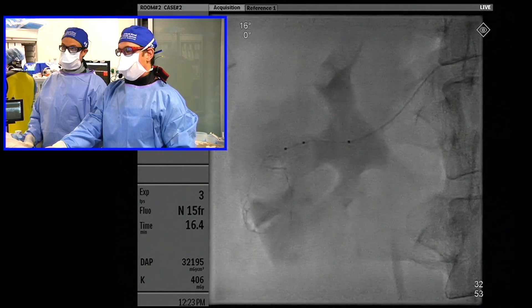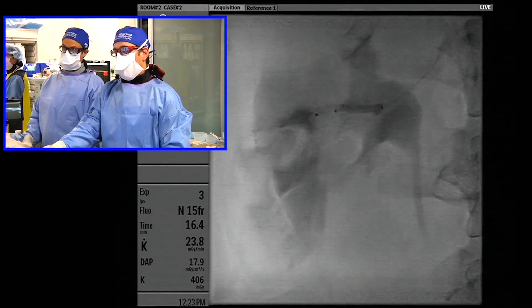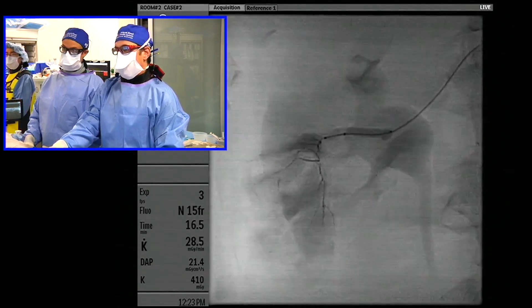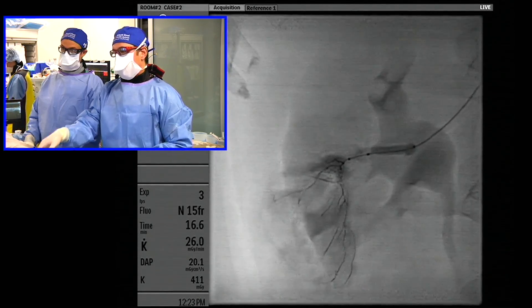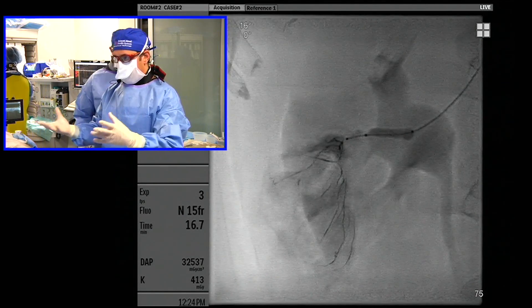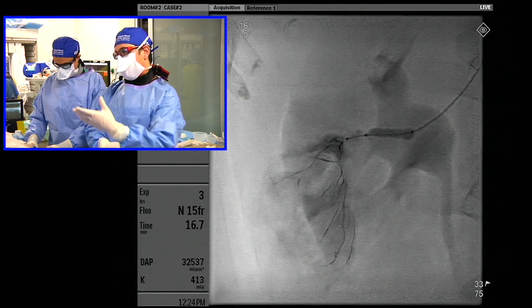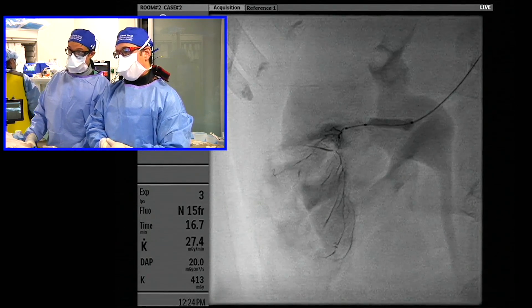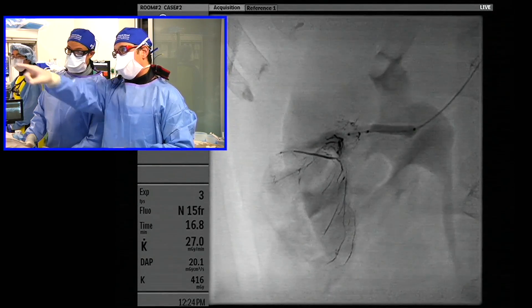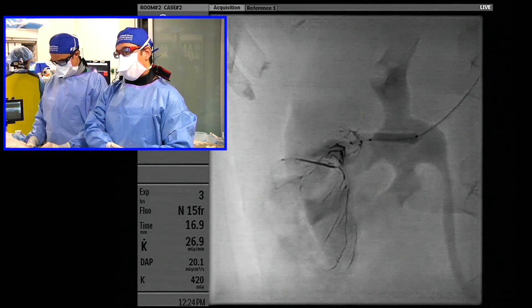We selected it — you can see the whole AML filling there. That's great. I probably didn't need to inflate the balloon, but you can see it's filling pretty nicely. That's what I was trying to do initially — use the balloon to get the Onyx to interdigitate into all these vessels. Now that we have that, we're going to put a little more in and be done. It's a quick injection once you get it in place; sometimes it takes a little while with these small vessels. Just go slow if it starts to reflux — it shouldn't, but sometimes it will. You can see a little bit came back there. We're probably done — it's a pretty quick injection, almost like glue.